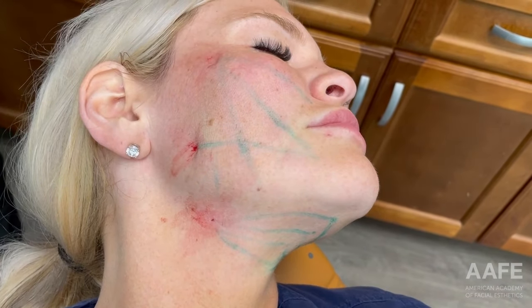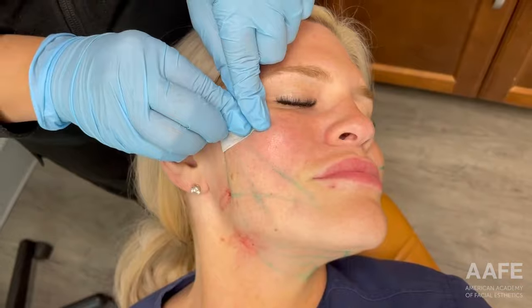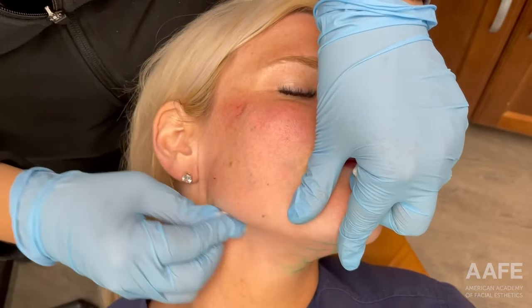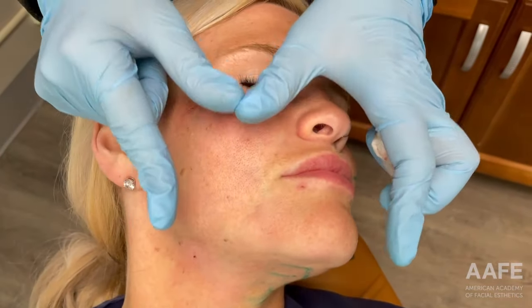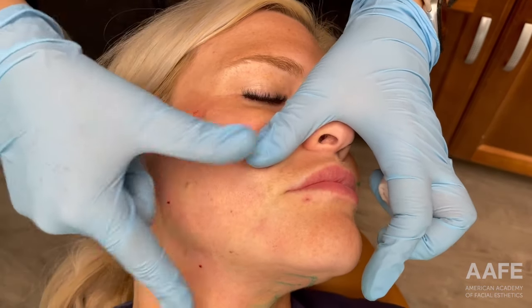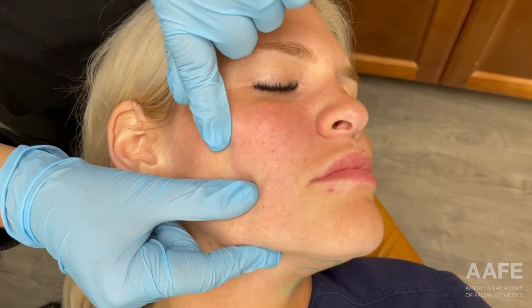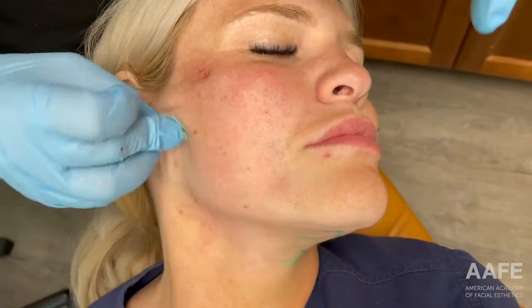Now we're going to swipe off our vectors and make sure all the barbs have engaged. These threads are bi-directional, meaning those barbs are going in both directions. In order to fully engage them, we need to be putting pressure on the thread going in both ways. Just going over it with my thumbs — you can feel those barbs catching, and she can probably feel them too. This is also working out any of the dimples that we can sometimes see with threads and making sure we're getting that ultimate lift. Then we'll put some band-aids on her and she's good to go.